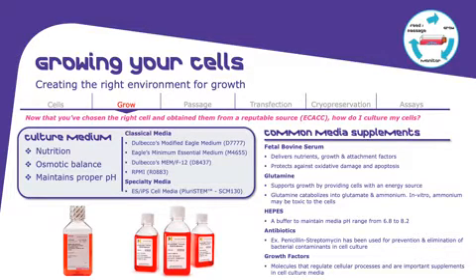It delivers nutrients, growth factors and attachment factors, so you need to add it in the right concentration. There are other supplements like glutamine, HEPES. Antibiotics, we do not really recommend using antibiotics. However, some media absolutely require them. And also there are a number of growth factors which are needed in order for the cells to feel happy.